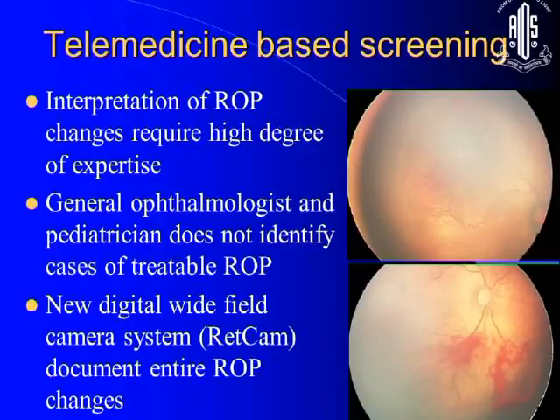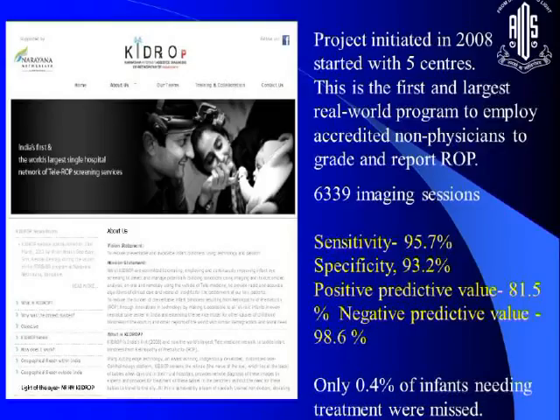Interpretation is not easy as far as ROP is concerned. We make mistakes. That's why it is such a great device, that you can send it to an expert and identify the treatables, because we have a very narrow window for treatment as far as ROP is concerned. So if you can take a wide-angle picture, it's a great tool.